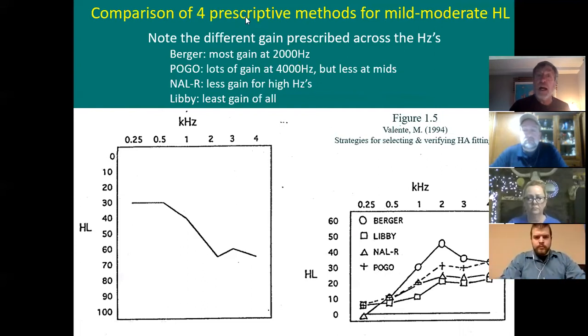And that is why NAL became the most popular fitting method in the world. Gone was Berger. I remember when I was studying audiology in grad school, 1988, and Berger was already out of fashion. It was all about POGO. Then a few years later, NAL-R came on the scene. Libby was tried by a few people, not many used it. And NAL-R became it. It hung the moon. Everybody was using NAL-R. In Europe, in the USA, Australia, Canada, everybody was using NAL. So of those 4 methods, NAL became by far the most popular.